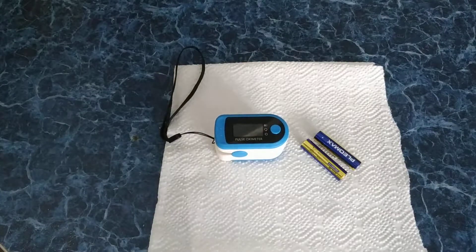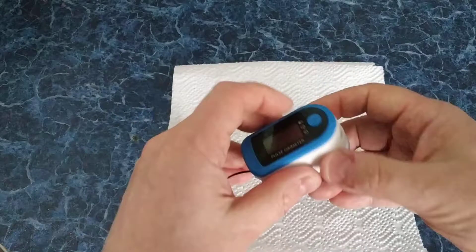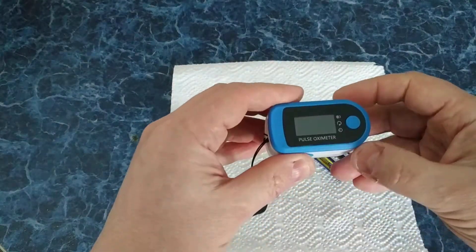Good day, friends, and let's check this magic device. It's called Pulse Oximeter.